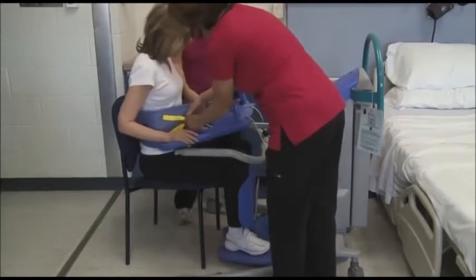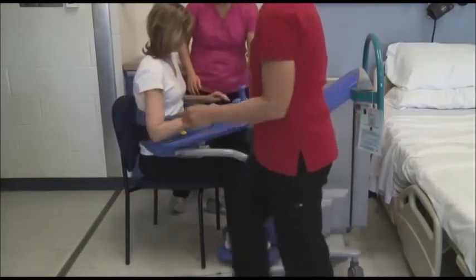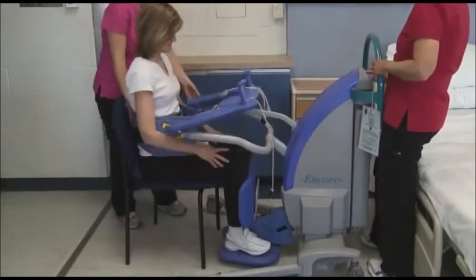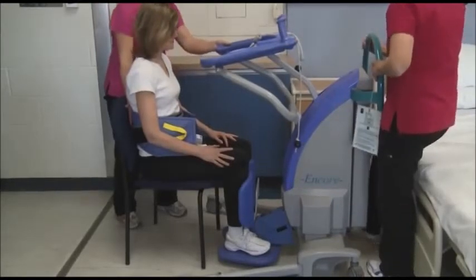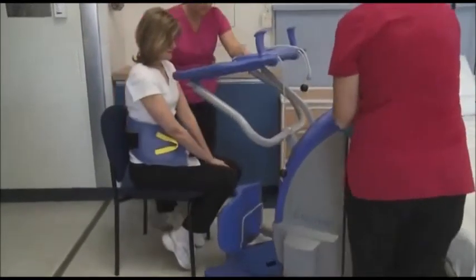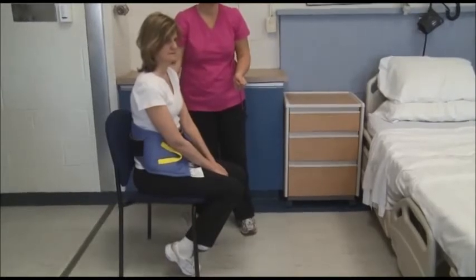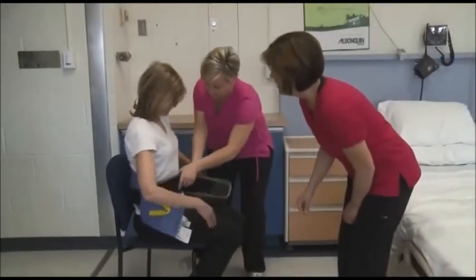We can loosen the belt. Okay. And I'm going to lift up the machine, unlock my brakes, and just lift your feet, Carmen. And we can remove the belt.